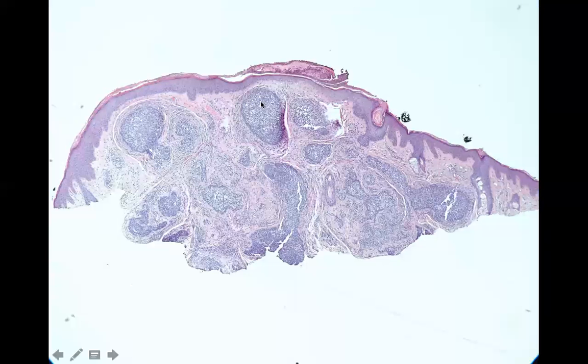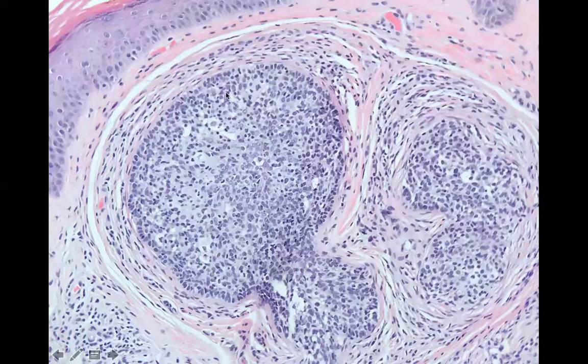Okay, so here's a trichoblastoma, blue balls in the dermis, right? Looks otherwise just like a basal cell, except you're noticing, hey, wait a minute, this stroma is separating from the collagen around it. It's not separating from the tumor like it does with basal cell carcinoma. And then you go and you're like, well, I see two cell types. I see these blue epithelial cells, and then I see these little black dots, which are my lymphocytes. And then I kind of get the sense that, well, why do you get all this white space? It's kind of like lymphocytes in the epidermis. It causes spongiosis and edema, and so I think that's why it's got that white-looking space. But this has got this weird name, lymphadenoma, which is a trichoblastoma with lymphocytes. And look at your beautiful stromal separation here.